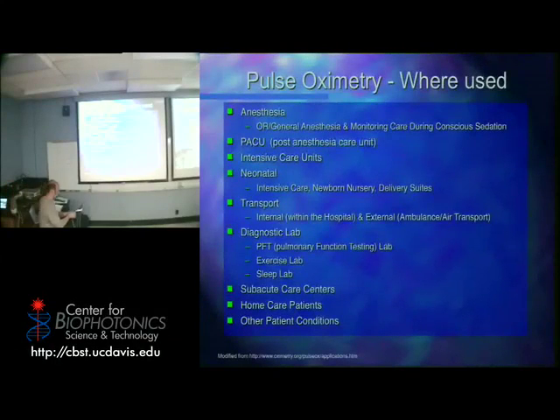The other thing I wanted to pass around for you guys to see is this is what they use in the hospital. They even have a little picture of the finger there. They put the finger like this, and they fold it over, and then they tape it onto your finger, and then this plugs into a machine. Okay? And then they throw these away. But this is from a company that does a lot with this, Masimo. And this one, basically everything has been built in there.